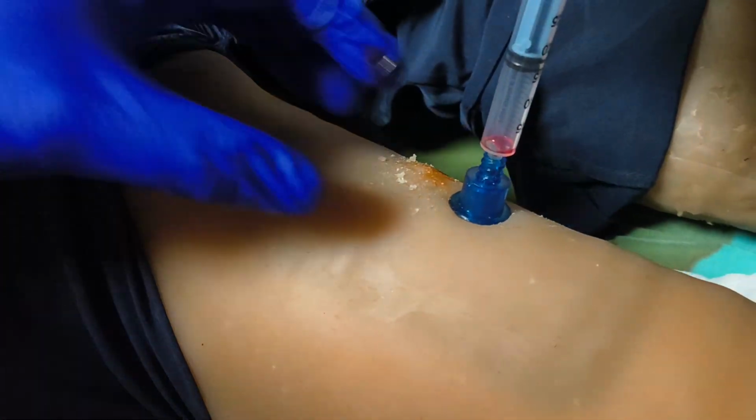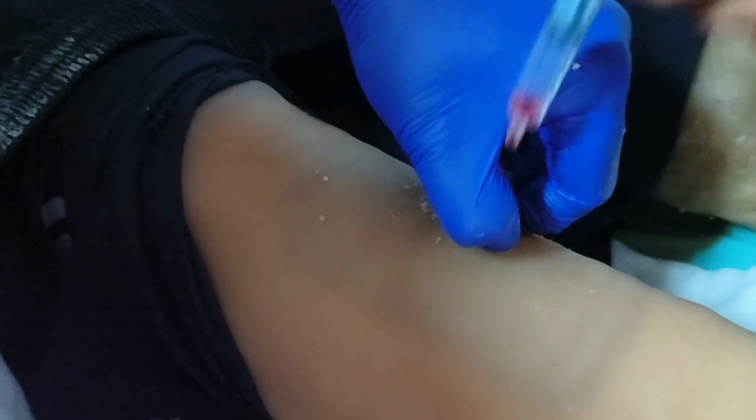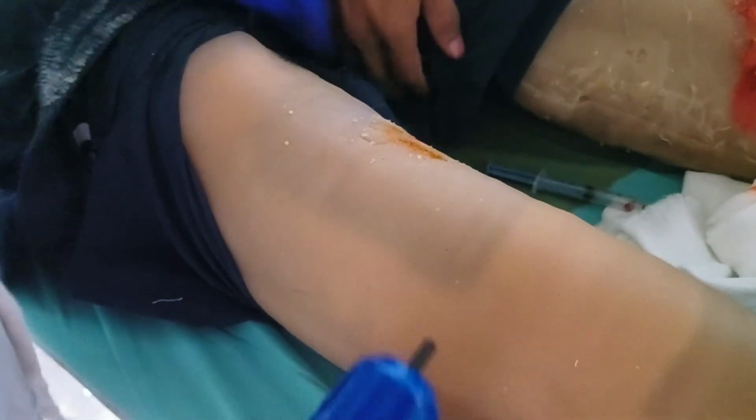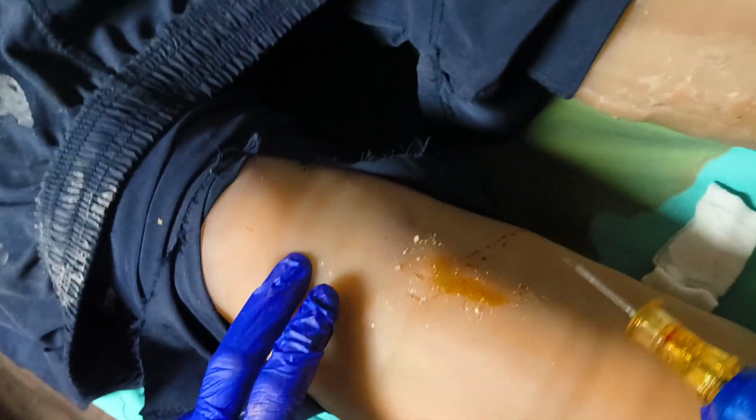Yes, it is not going into the marrow because of the length. Now we will try. Give me yellow. Because you can attempt a number of times.